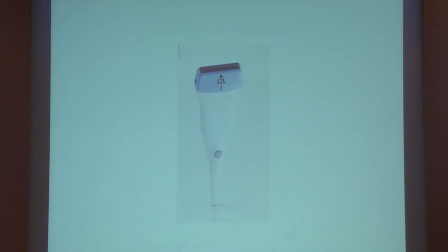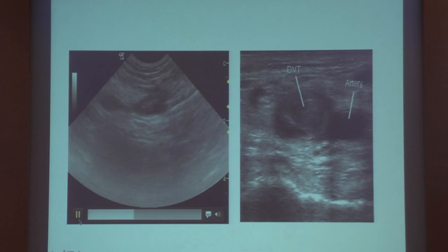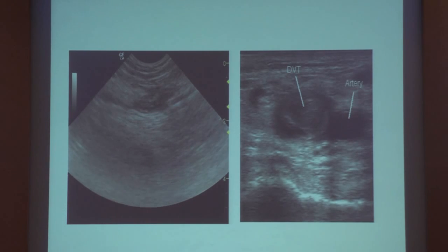And that's where bedside ultrasound comes in. Of course, it is not the be-all and end-all of the diagnosis of DVT and pulmonary embolism, but if you see something by the bedside, it certainly will give you a very important clue. To look at the veins of your lower extremity by compression ultrasonography, you use a high-frequency probe like this. What you need to do is place the probe in the inguinal region and apply pressure.